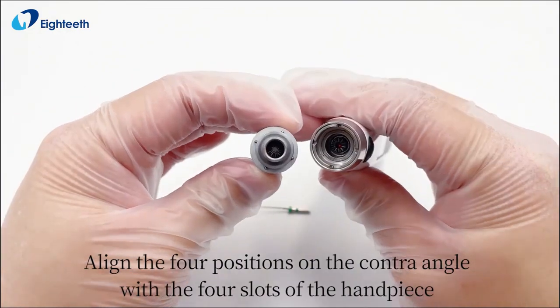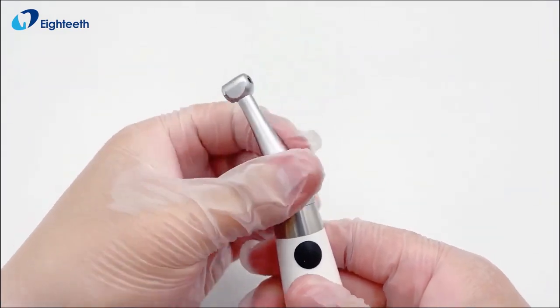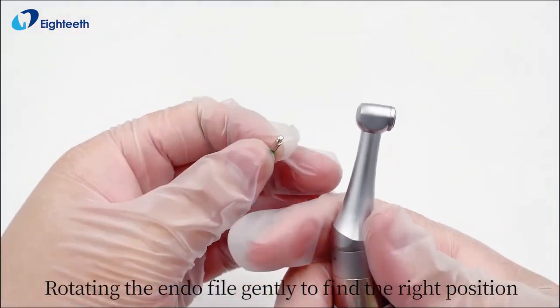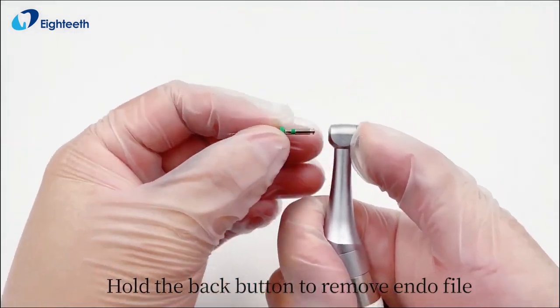Align the four positions on the contra angle with the four slots of the handpiece and install the contra angle on the handpiece. Rotate the endo file gently to find the right position, then push it gently inside the contra angle. Hold the back button to remove the endo file.